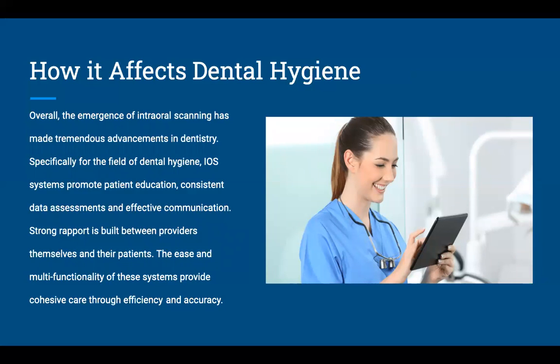With the data assessments, you are able to see the progression and progress of a patient's dentition along with their oral hygiene, and it keeps them accountable. And like I said before, it creates that effective communication between the patient and also the providers.